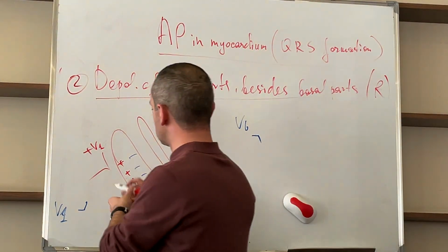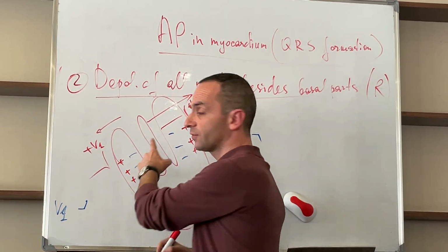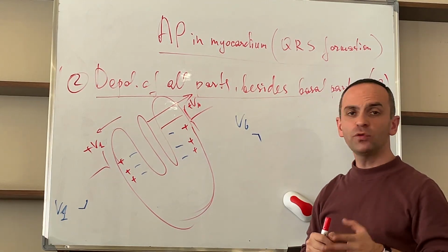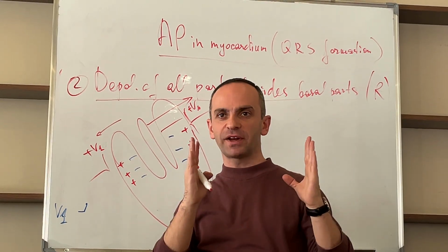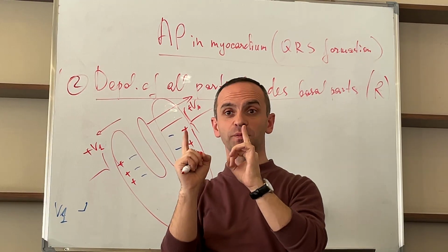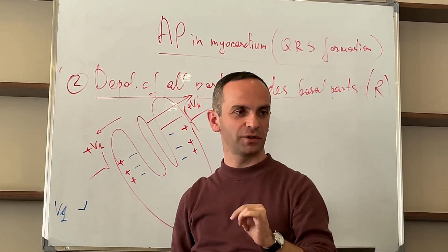One vector is this, negative to positive, and the second vector is this. Left ventricular mass electrical activity is higher, so the vector is larger. If we have two vectors with opposite directions, for their summary we take and subtract the smaller one from the larger one. The difference will be our summary vector, which has the direction of the biggest one.